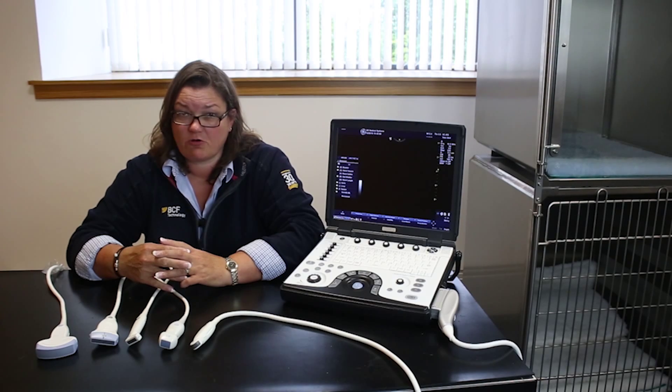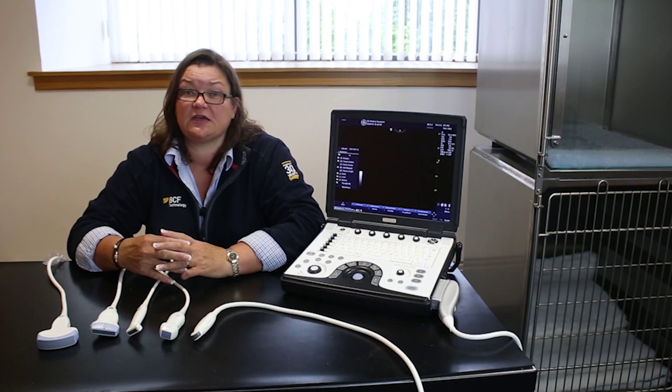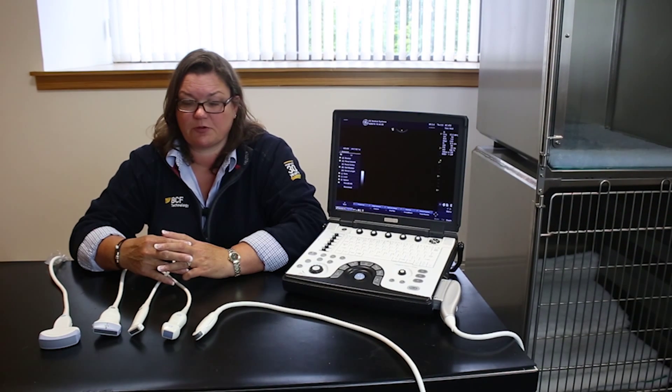For large dogs or for large animal work — so cardiology and equines, for example — there's a lower frequency, larger phased array probe available.